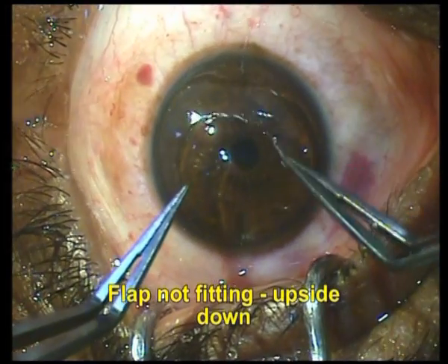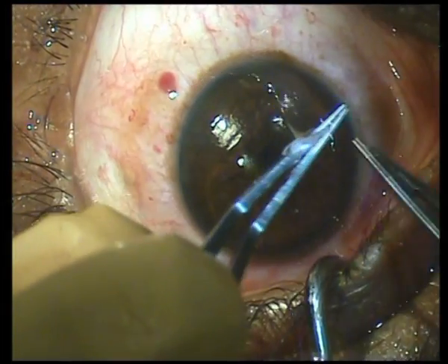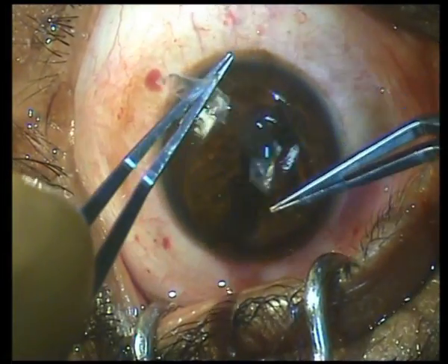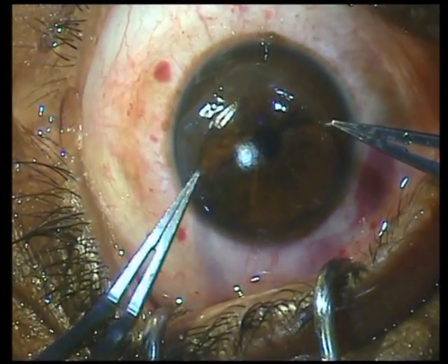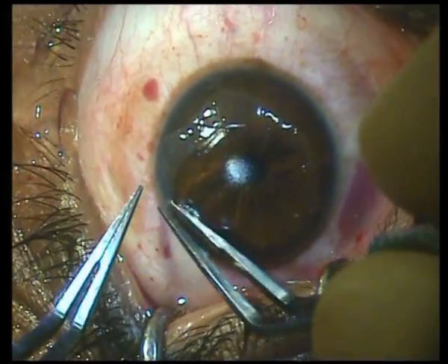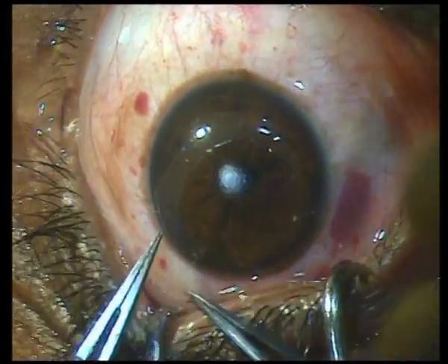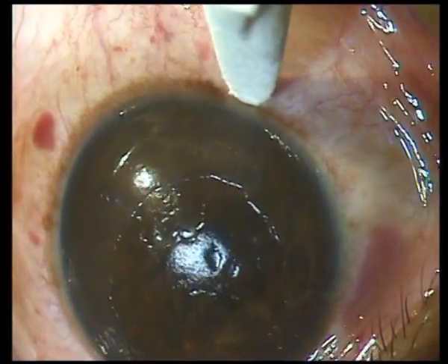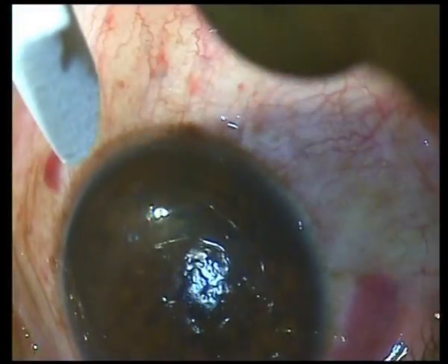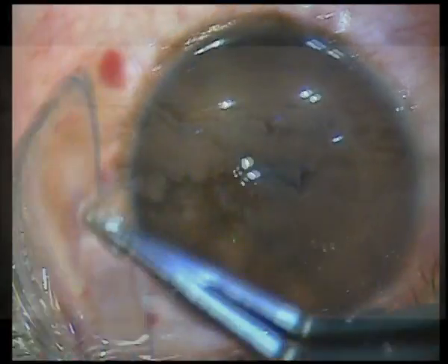Was it an upside-down cap? It certainly seemed so. On reversing it, it fit perfectly like a jigsaw puzzle. A 5-minute wait, followed by the striae test again to confirm adhesion, and the longest refractive day finally seemed to be getting over.